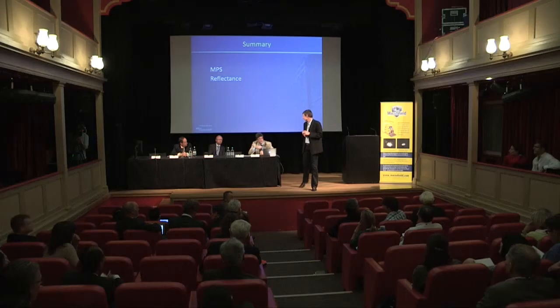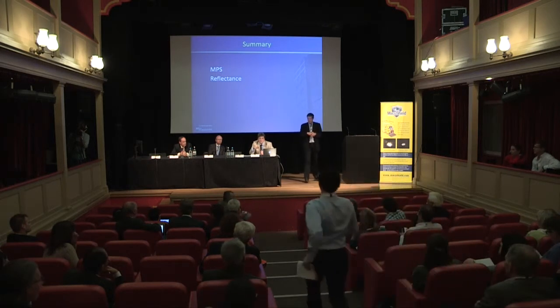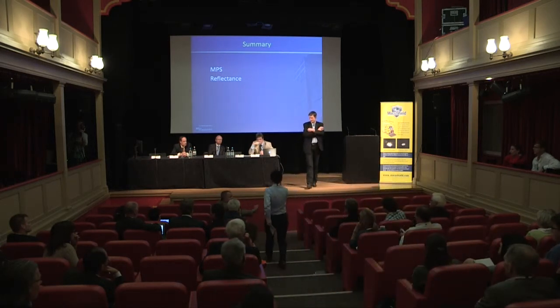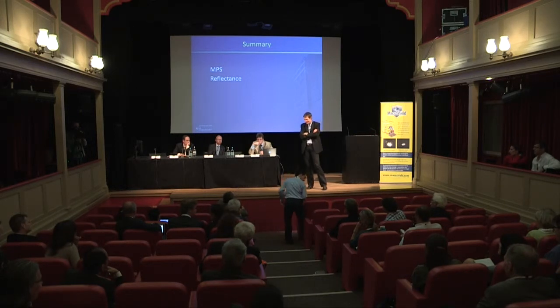Okay, any further questions? One more. One quick question, and I apologize, it's not going to be as brilliant as the presentation. I don't even know if you can answer it because this is your device. MPS2 now takes fovea and parafovea. MPS1 has been used for years, only took fovea.